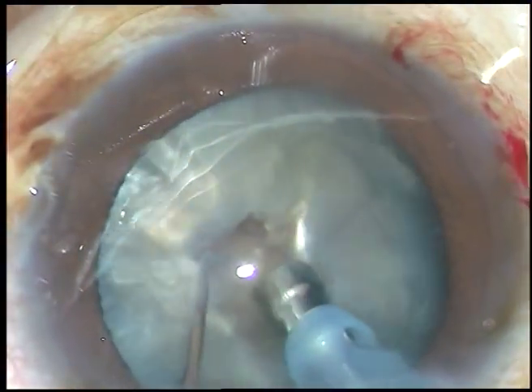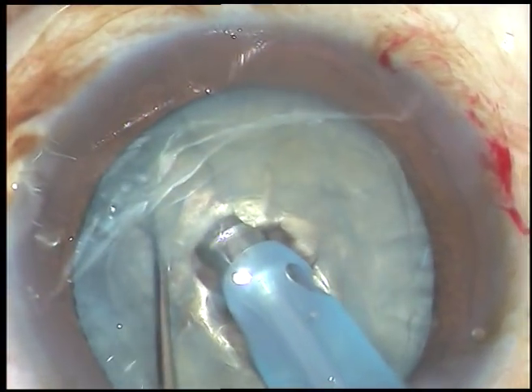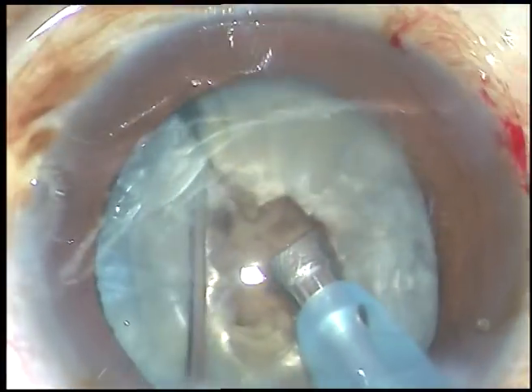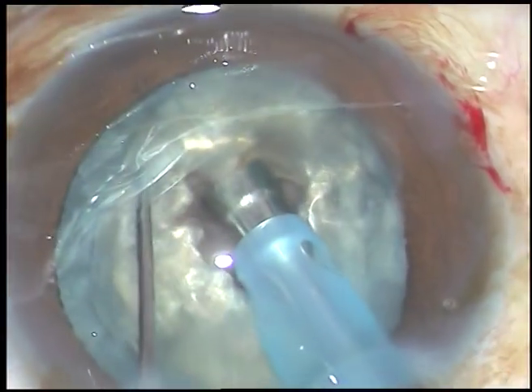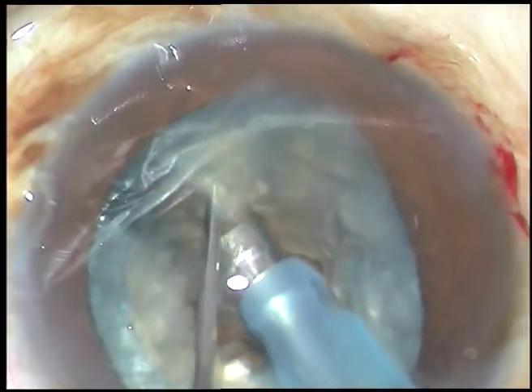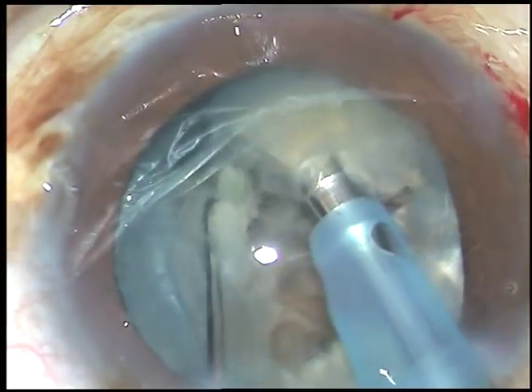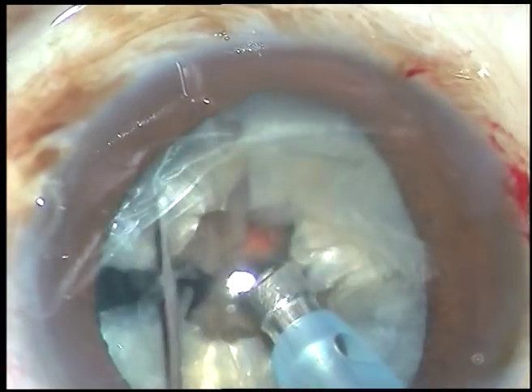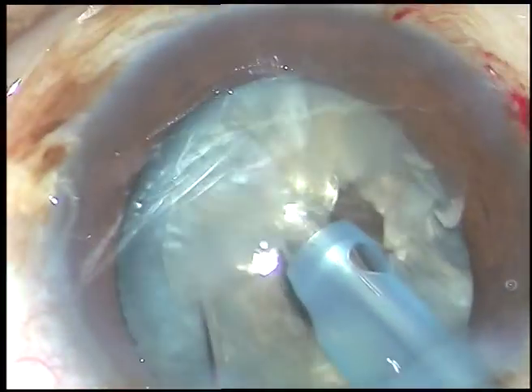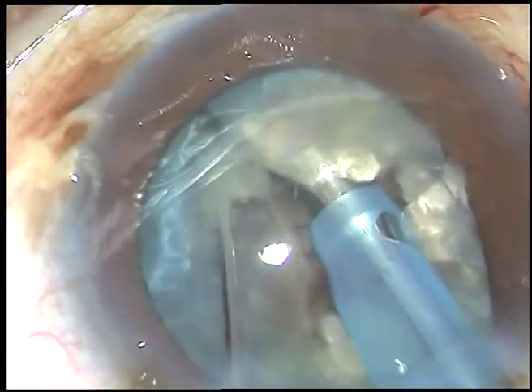Now see how I am going to chop this nucleus. I am in phaco 2 mode, vacuum is 450. I have been able to get a good crack. Now I rotate it 180 degrees, hold one half of the nucleus and separate the other half along the crack of the first chop. This is another chop of one hemi-nucleus and another chop of the other hemi-nucleus.